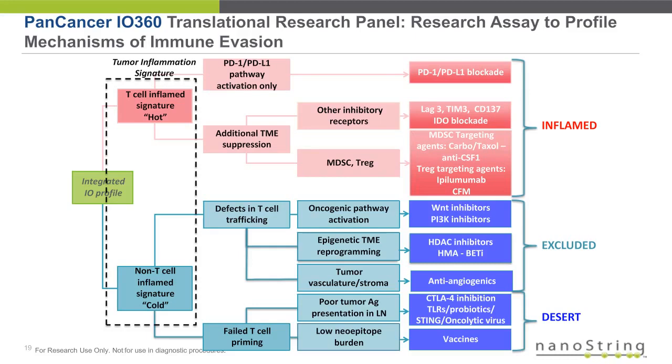And the goal of this assay is really to provide an actionable profile of tumor immune interactions that can then help guide research and development around novel immunotherapies.